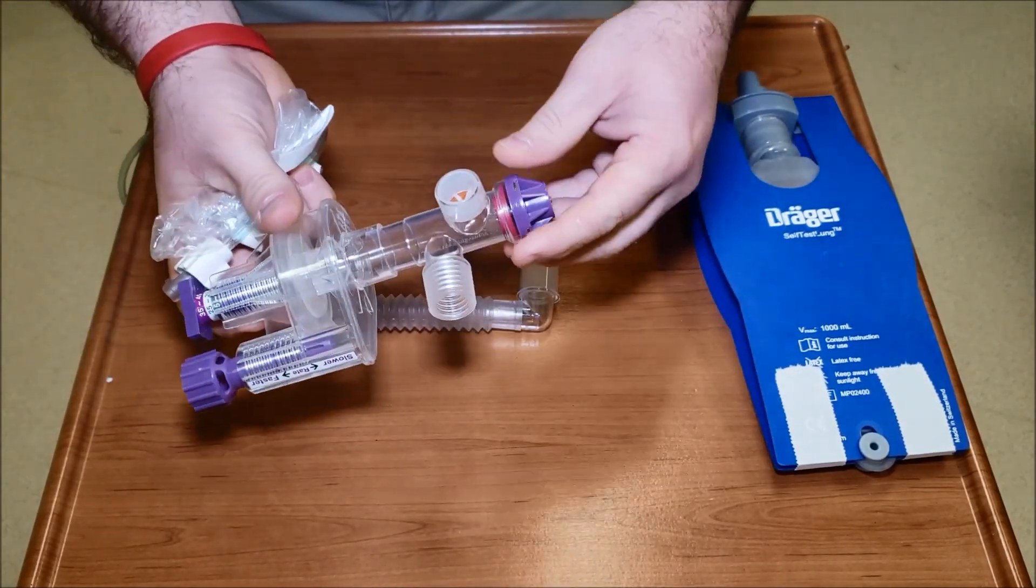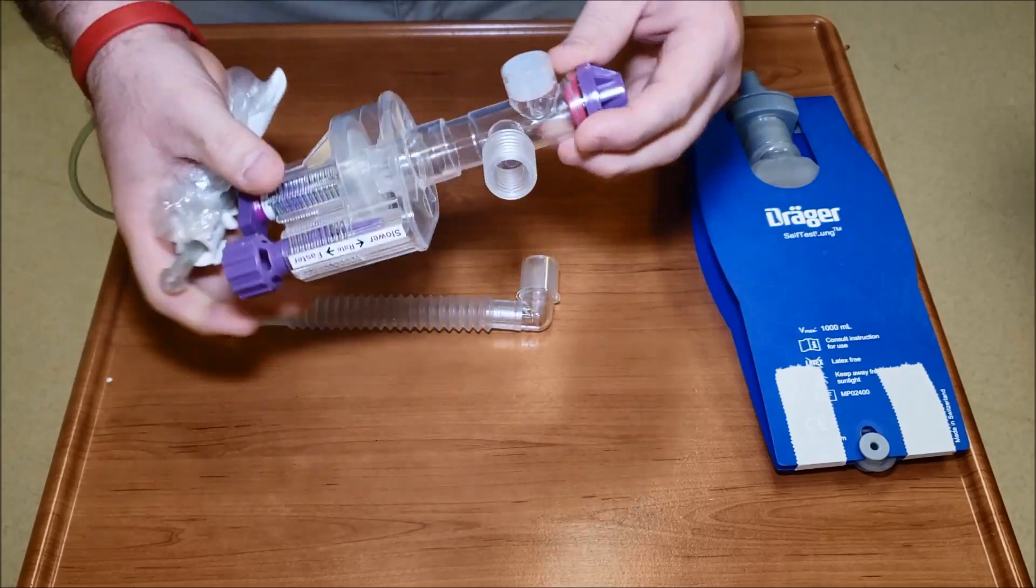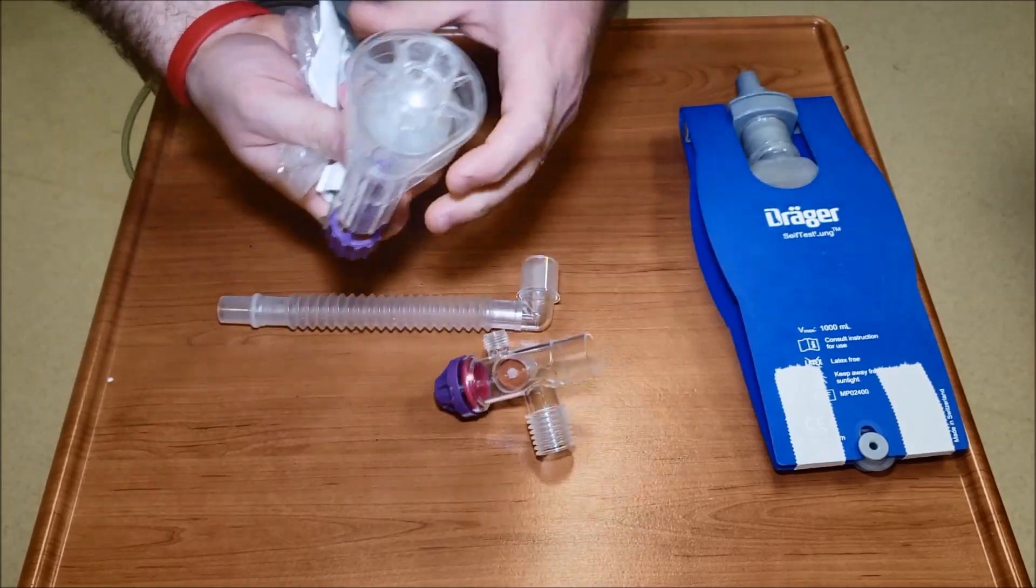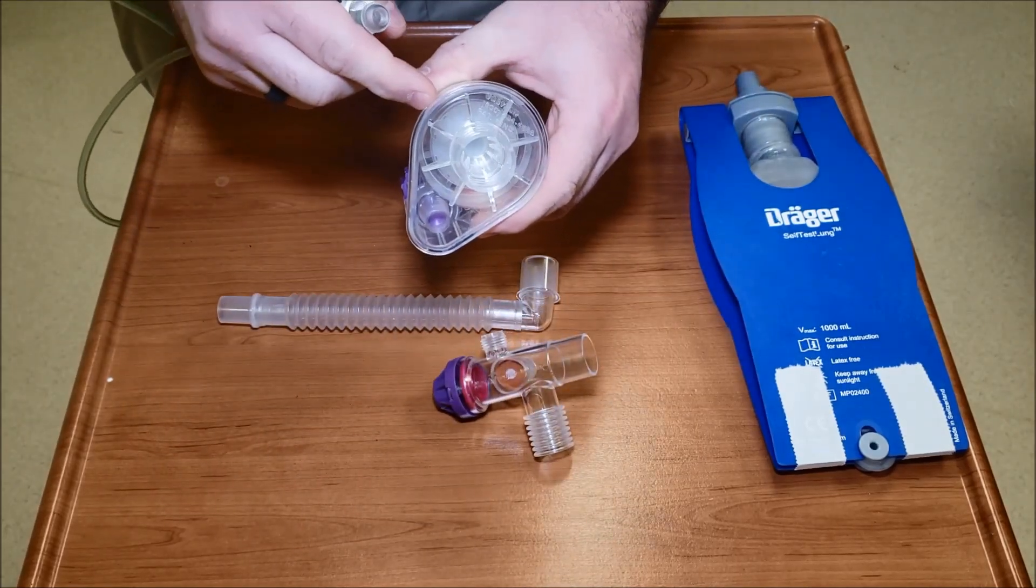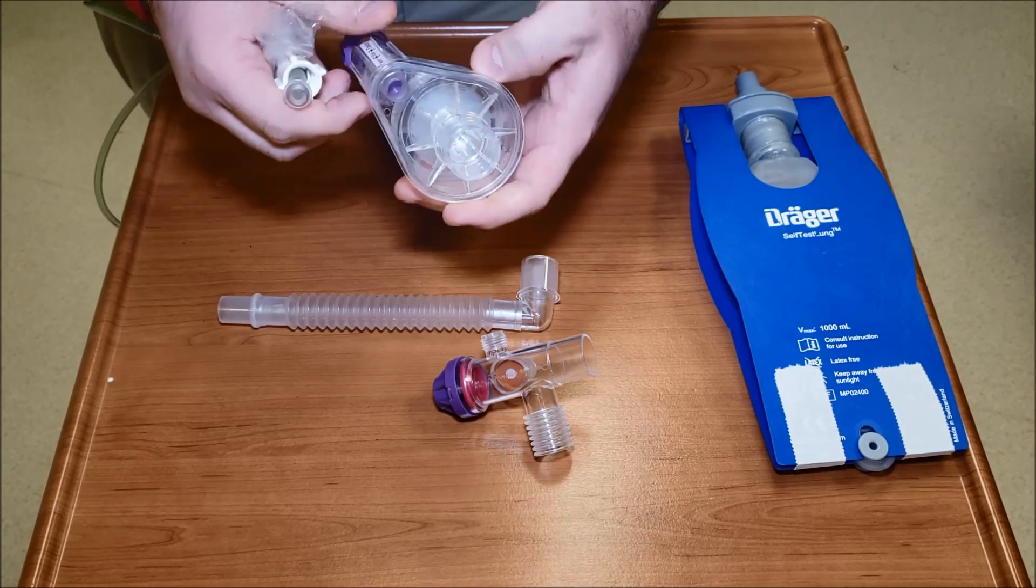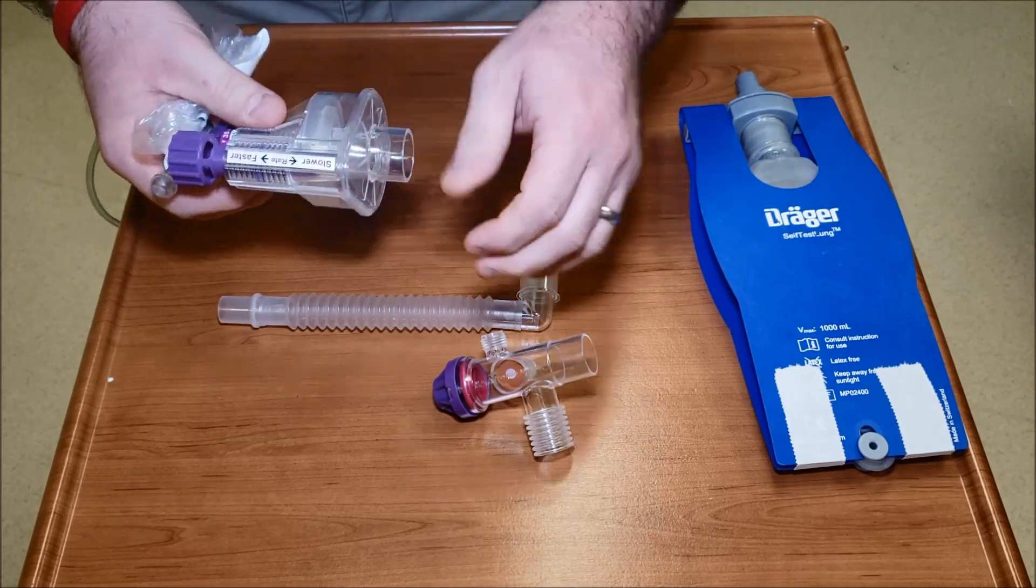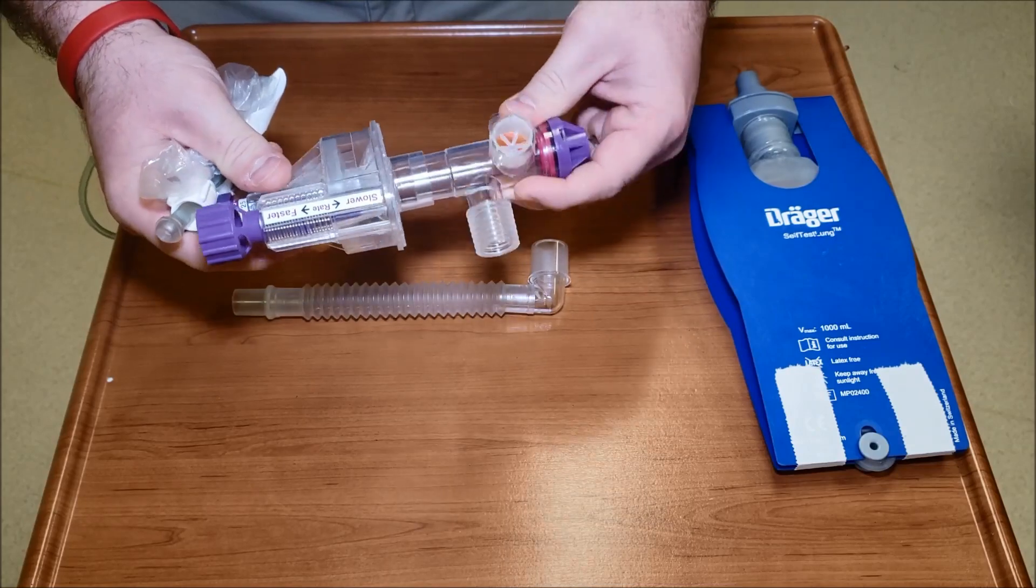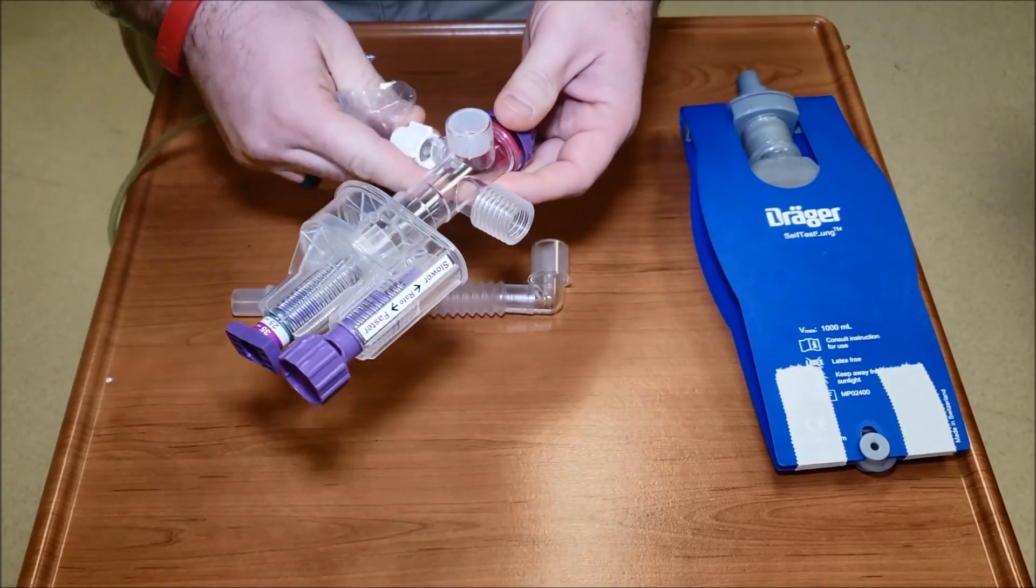You're going to see this is the automatic resuscitator. This is where your diaphragm is located inside of there. That's the part that becomes real sticky if it's expired and it will not cycle, which is a major problem trying to ventilate.